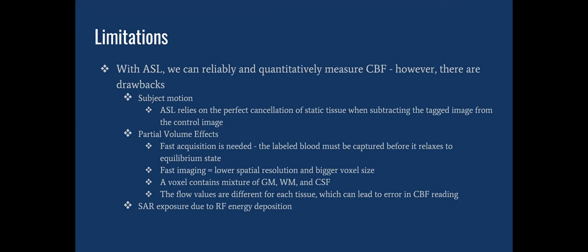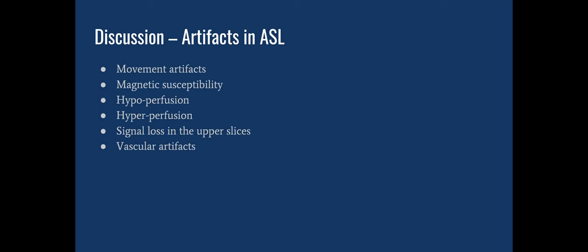So the limitation is, although we can reliably and quantitatively measure CBF, there are drawbacks: subject motion, partial volume effects, and the SAR or the exposure due to RF energy deposition are also some of the limitations of ASL. And these are some of the common artifacts that we see in ASL.